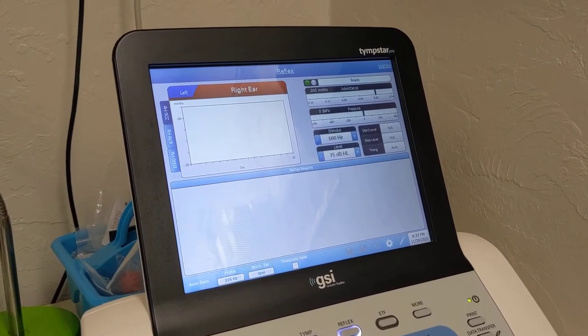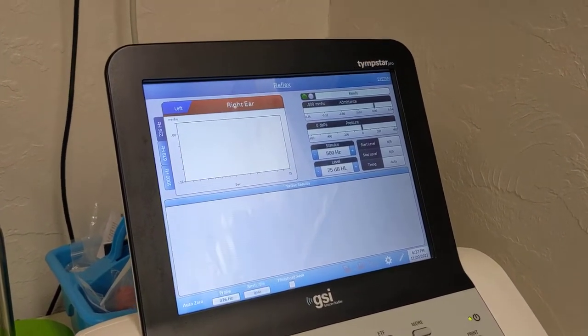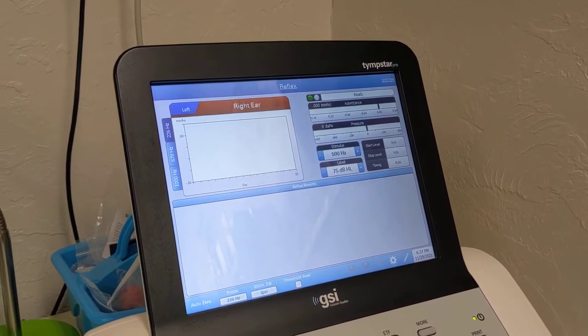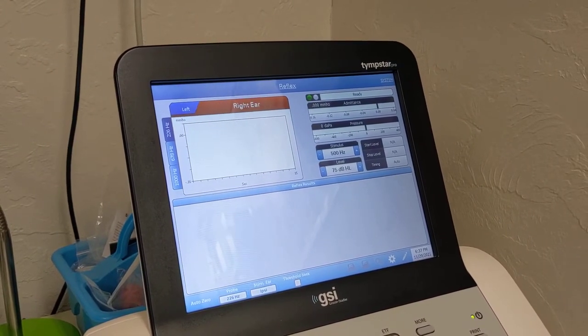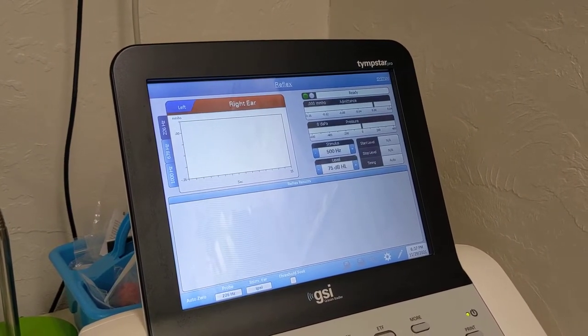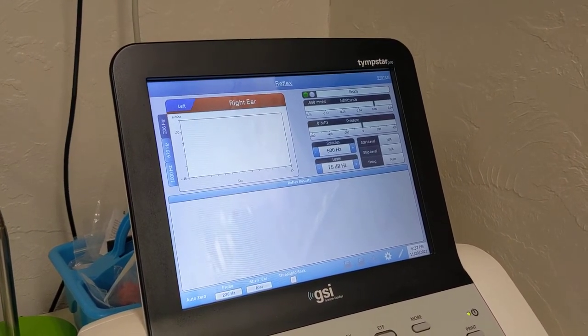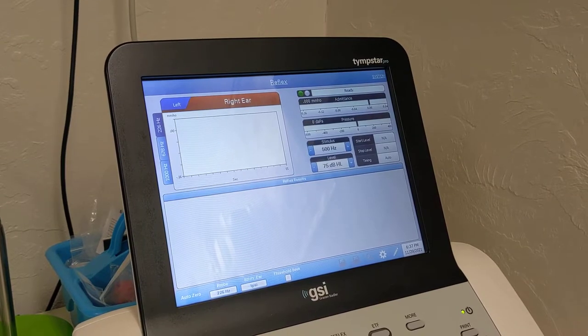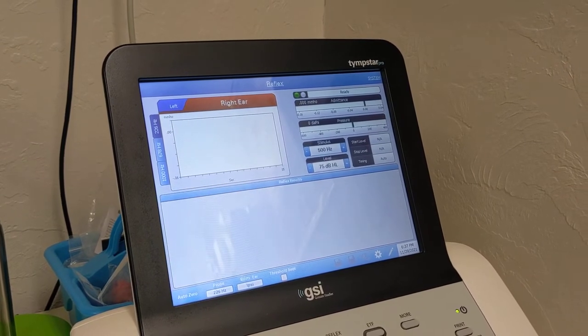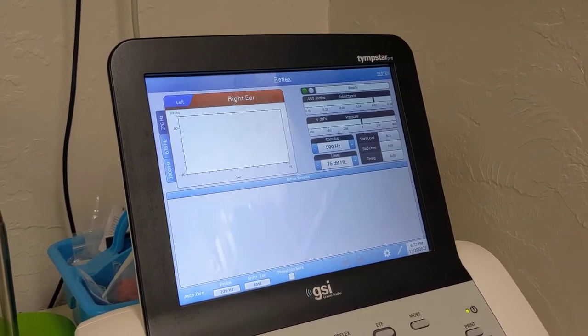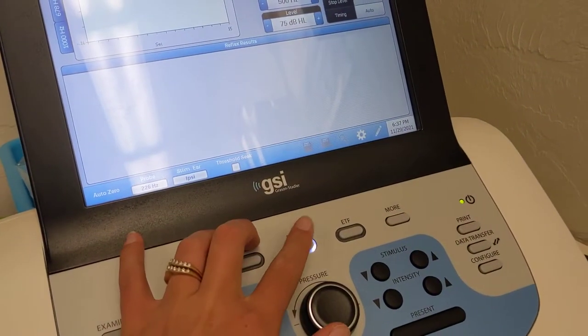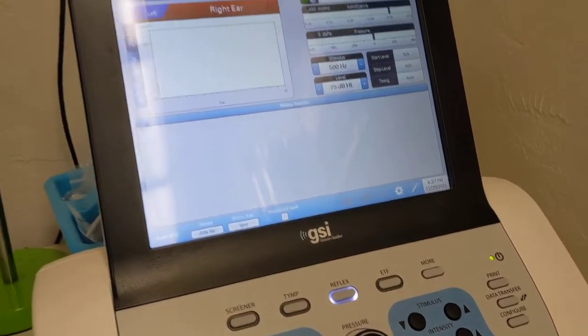So we have the GSI turned on and I made sure the equipment is working. After that I navigated to the appropriate test by clicking this Reflex button.